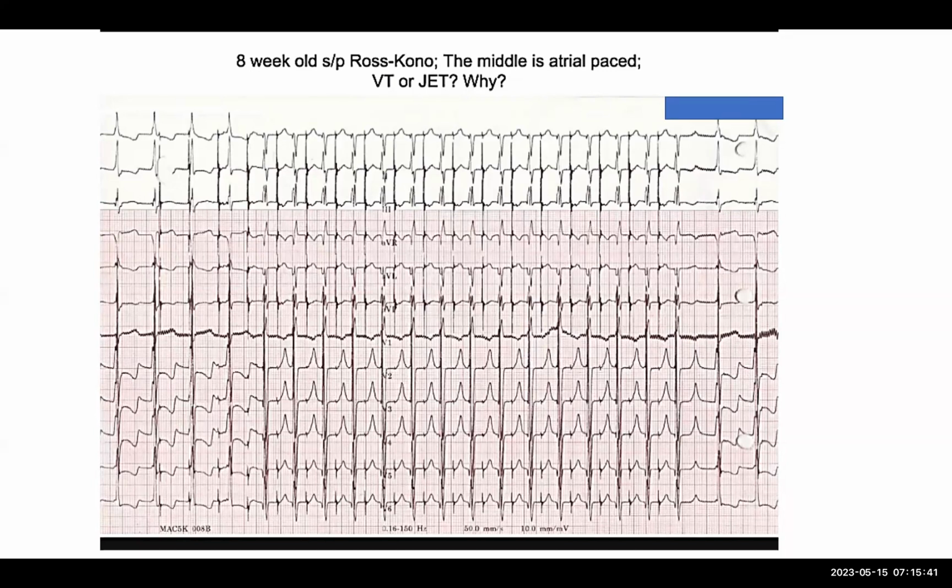One of the old-fashioned treatments for patients with atrial fibrillation was to ablate the AV node, put somebody on anticoagulation and put in a pacemaker. One of the most common ways it was done was to pass a catheter retrograde across the aortic valve, find the His bundle and just blast away. This was also done in Fontan patients who would have flutter, in an era before ablation for flutter or IART in Fontans. It was a technique described to ablate from the left side.